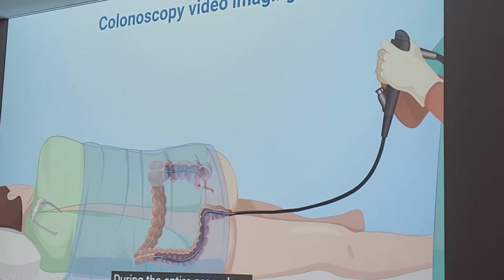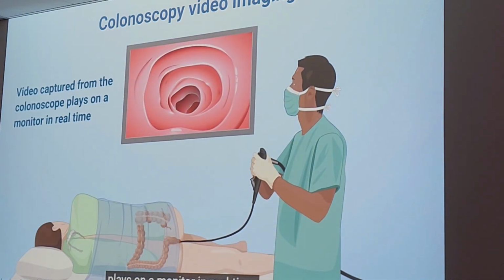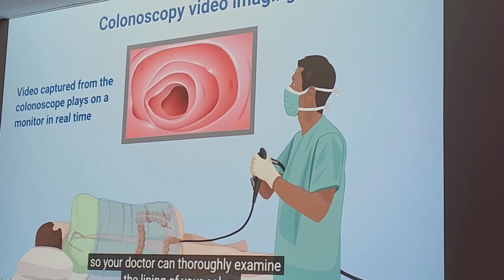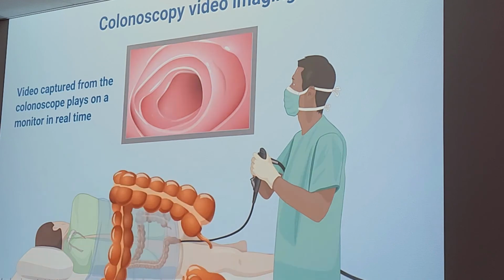During the entire procedure, a magnified high-definition video from the colonoscope plays on a monitor in real time, so your doctor can thoroughly examine the lining of your colon. Video may be recorded, and photos are taken as well.